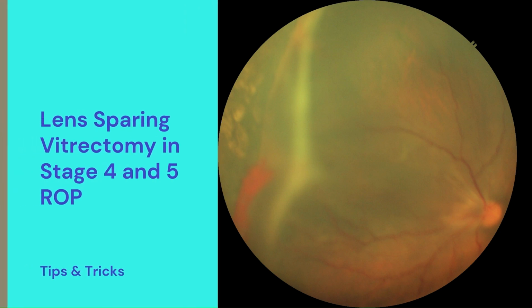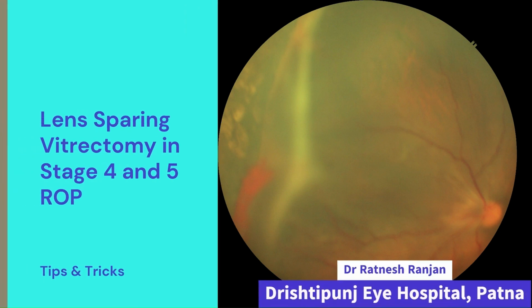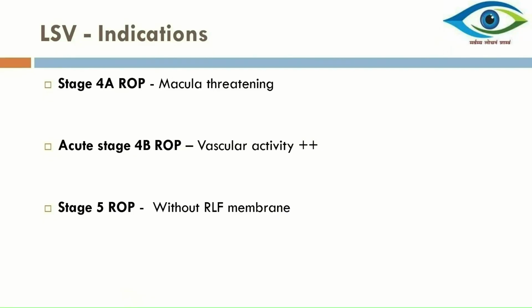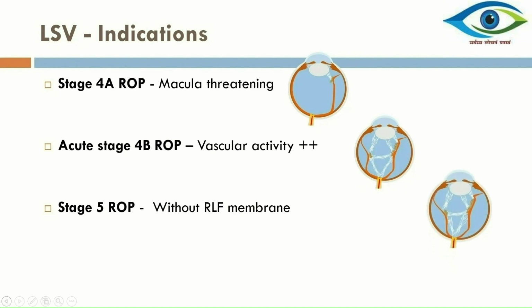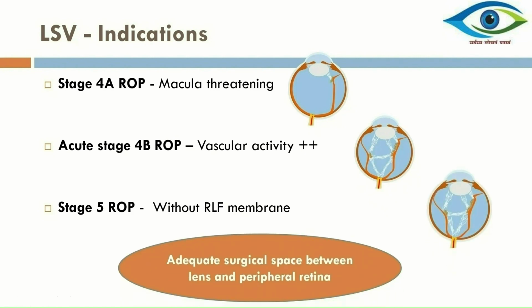This video will discuss the tips and tricks for lens-sparing vitrectomy in stage 4 and 5 ROP. The indications for lens-sparing vitrectomy include stage 4A ROP with progressive traction threatening the macula despite adequate laser to the peripheral avascular retina, acute vascularly active stage 4B ROP with risk of further progression, and stage 5 ROP without retrolental fibroplasia. Irrespective of the stage of ROP, the main prerequisite for performing lens-sparing vitrectomy is the presence of adequate surgical space between the lens and the anteriorly displaced retina.